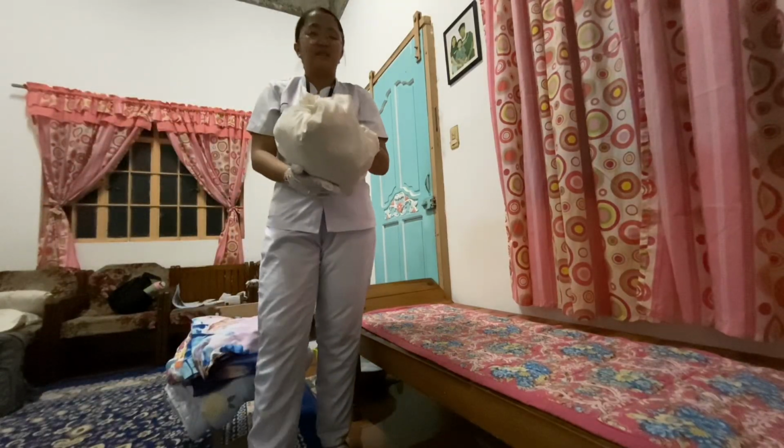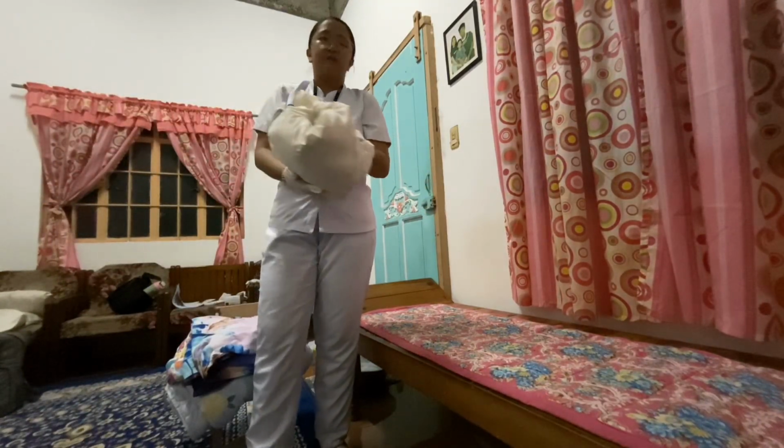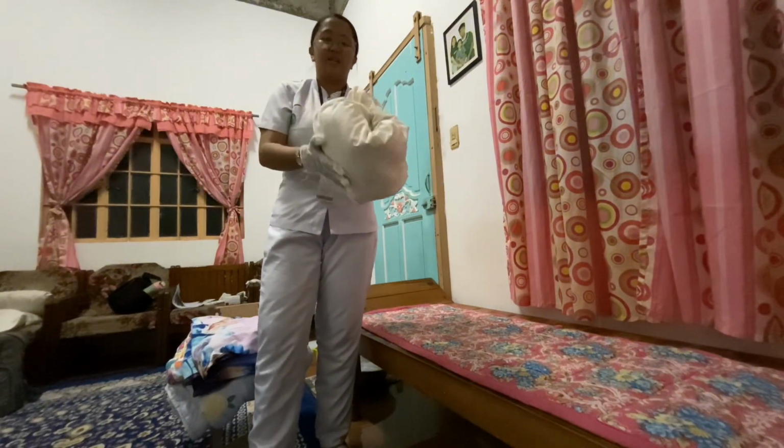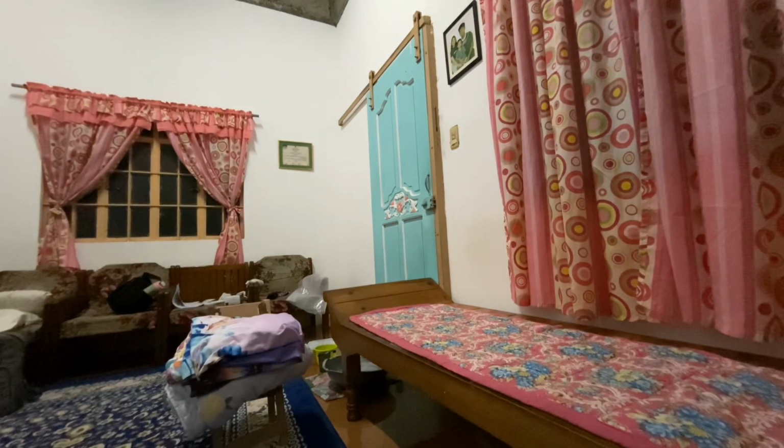So if ang linens naman po natin is katulad ng mga blankets, if reusable po sila, we can hang them over a clean table. But if not, isasama po natin sila sa loob nito, and ilalagay po natin sila sa disposable linen container. If possible, shift the mattress up to the head of the bed. If the mattress is soiled, clean and dry according to facility policy before applying new sheets.